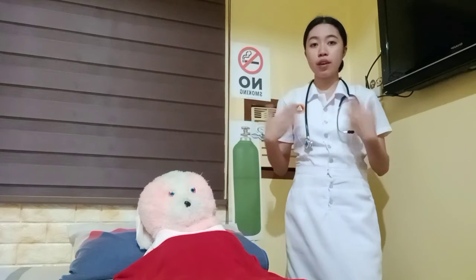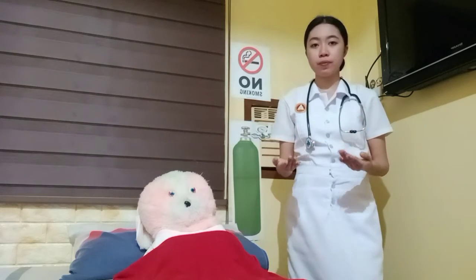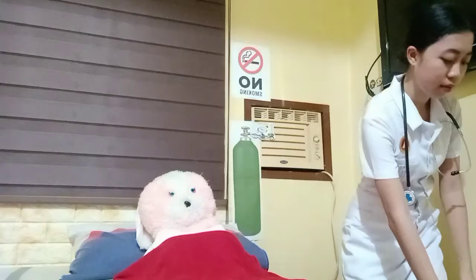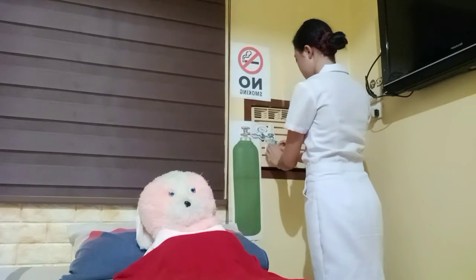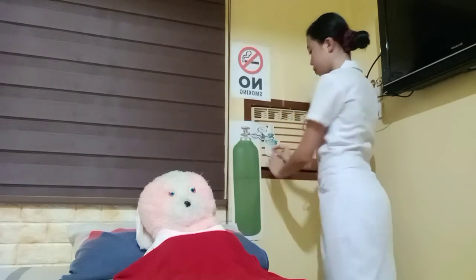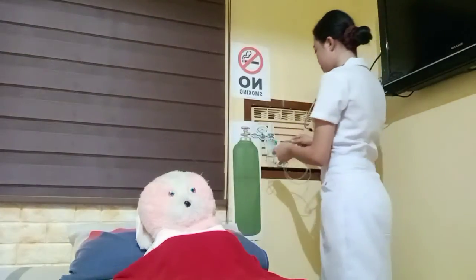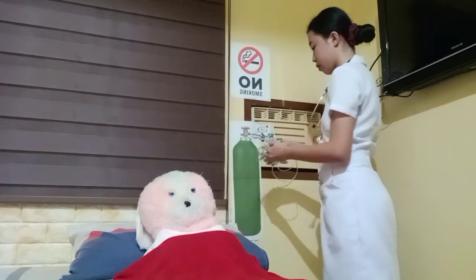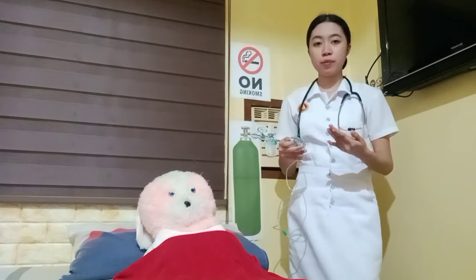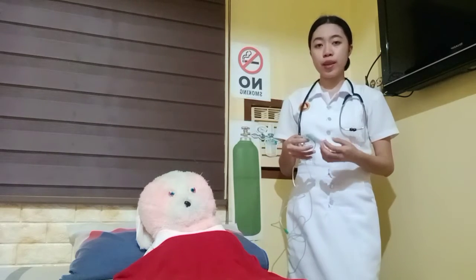If you're using a high oxygen flow, attach the oxygen tubing to the humidifier. Turn on the oxygen at the prescribed rate and then check if the oxygen is flowing through the tubing.